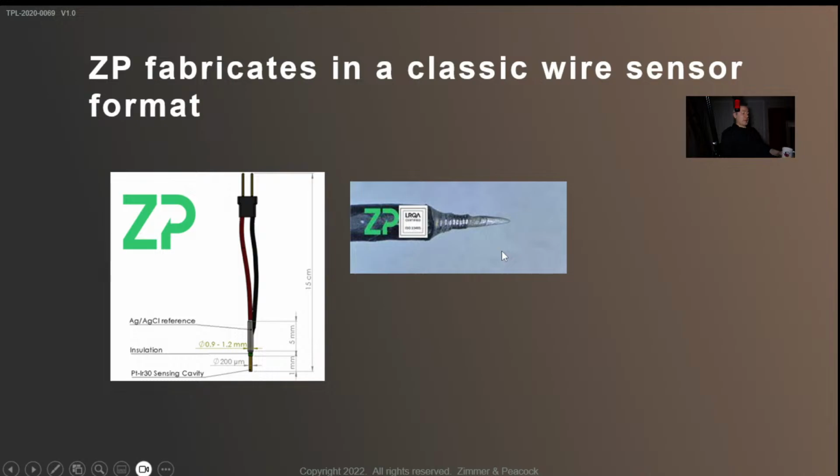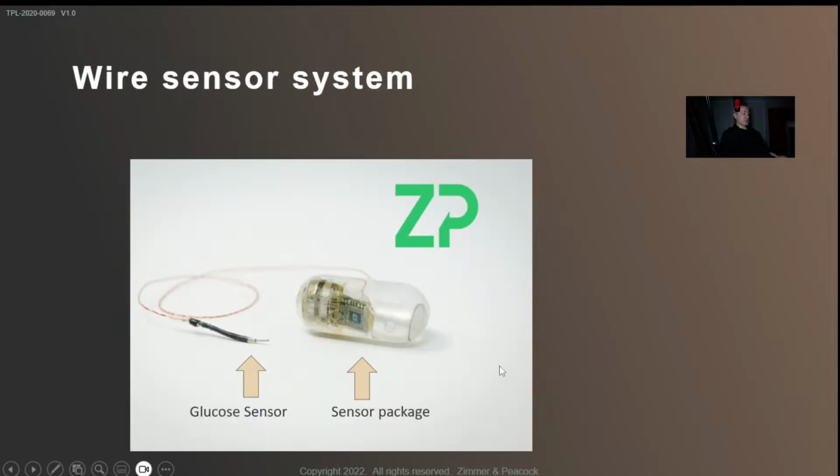Classic wire format may not sound so classic to you because you may not be in our field, but if you know these CGMs, these continuous glucose monitors that people are wearing, these little patches, they're using what's called a transdermal filament, but you could also call them wire systems. So we're pretty familiar with that. In fact, we have built this system in two versions, one for glucose and one for cortisol.